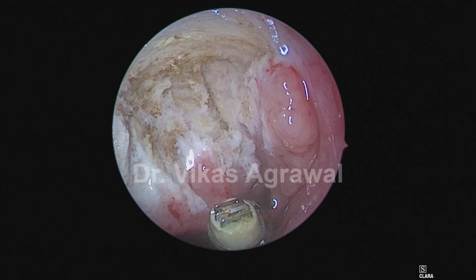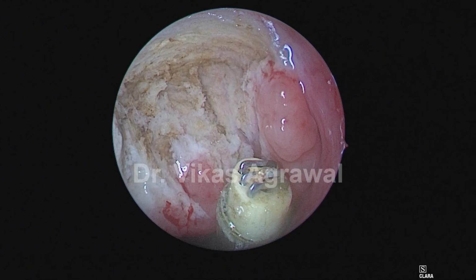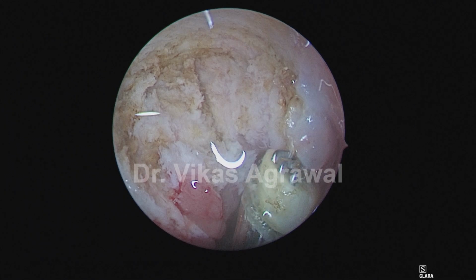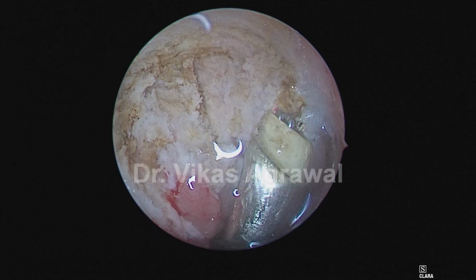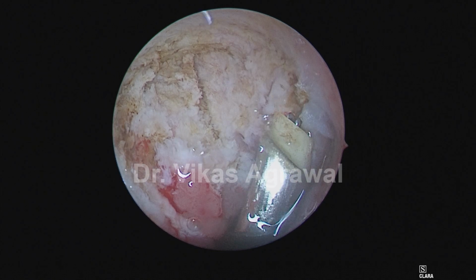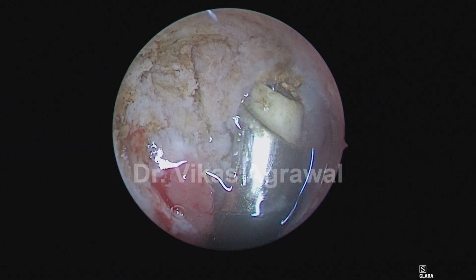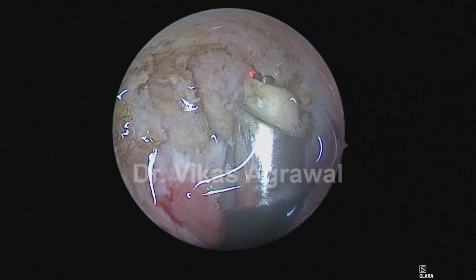Now we'll go for the lateral boundary. So the lateral boundary, you can see the eustachian tube here. That's the torus tubarius, and this is the lymphoid tissue on the torus tubarius called the tubal tonsil. So I'll remove all the tubal tonsil, but I'll remain say 5 millimeter away from the eustachian tube orifice. That is the lateral boundary in the anterior part.